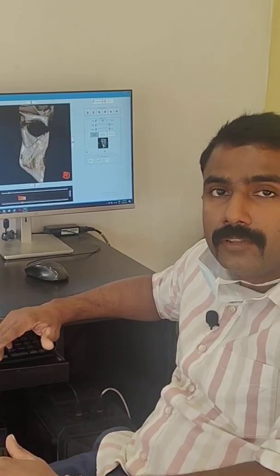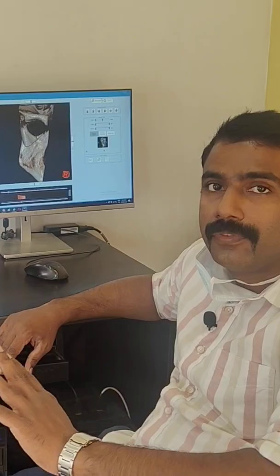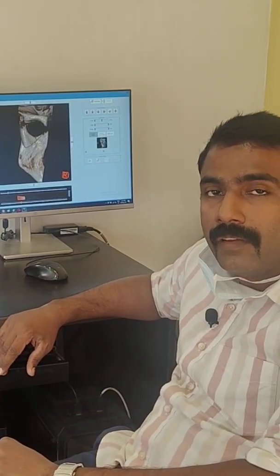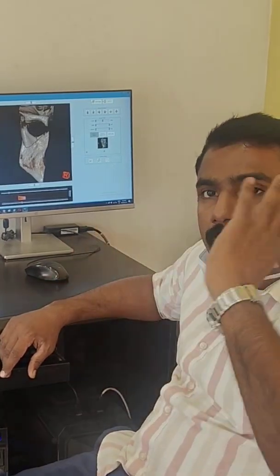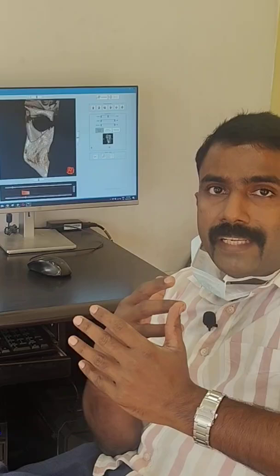Hi friends, welcome to Diagnox. Today I am going to show you a case of subcondylar fracture with the help of cone beam computed tomography. We all know that this subcondylar region is a very weak region, and when a patient is subjected to trauma in the mandible, especially in the chin, there is a probable chance of a subcondylar fracture. There is an important clinical sign: when a patient opens his or her mouth, the jaw would be deviated towards the site of fracture.